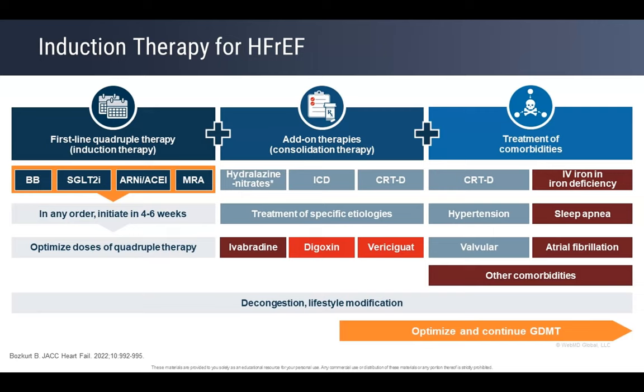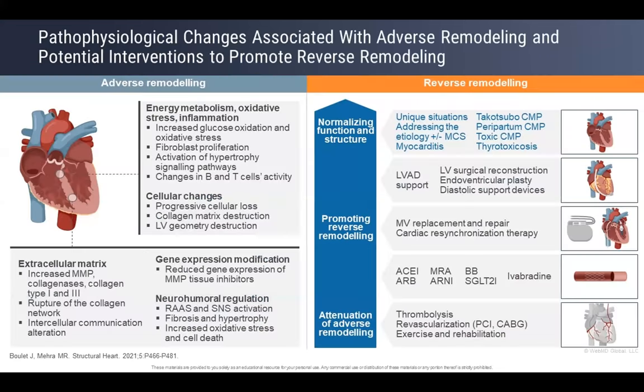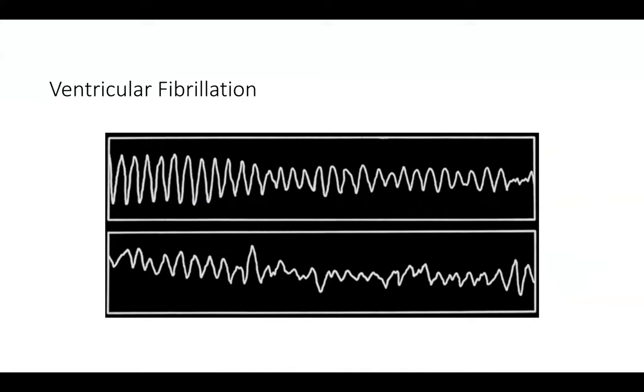So any of them that qualify for CRT-D, if there is a need to add on a defibrillator, then fine. But for the frail elderly, chronic kidney disease that will require a lot of diuresis, or cachexia, you may not have enough space for a very huge battery. As I said, the patient is always individualized. So these are reasons where you can argue for a CRT-P. If not, and the patient requires a defibrillator in the course of the heart failure, then it's better you go for a CRT-D. Okay, so the aim of all this therapy is to modify the physiology of heart failure.